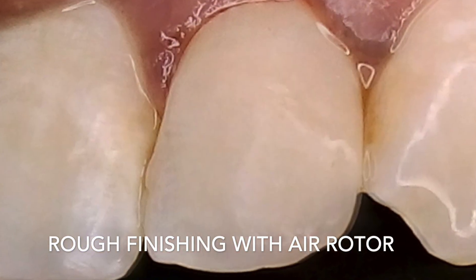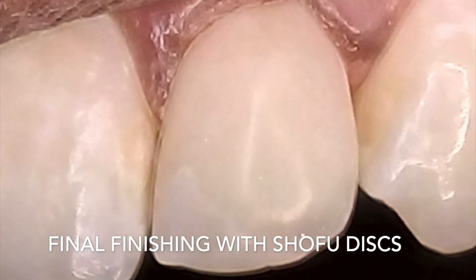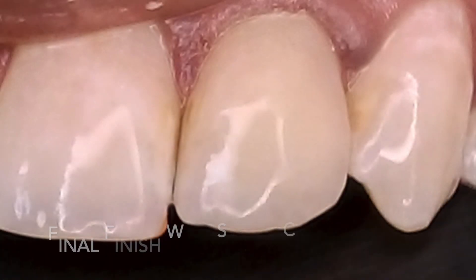The next series of steps started with rough finishing using an air rotor, followed by Shofu coarse and medium discs to get the shape and smoothness desired. Pre-polishing was done with the Shofu Super Buff.